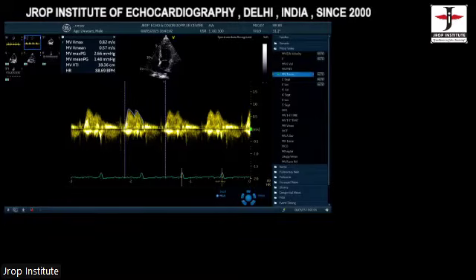While going through the color Doppler across the mitral valve, you mentioned, sir, two methods. One is pulse wave Doppler, and the second is continuous wave Doppler. When do we use pulse wave? In normal circumstances, we always use pulse wave Doppler. Whenever there is a stenotic lesion, as you see on the screen, look, my Doppler spectrum pattern is easily measurable. Correct?